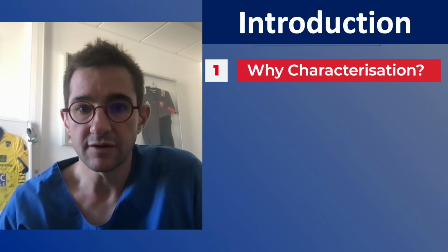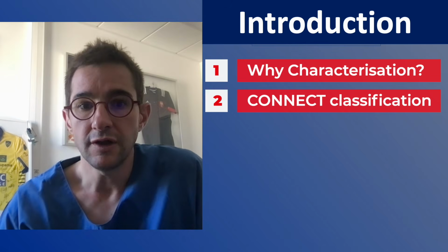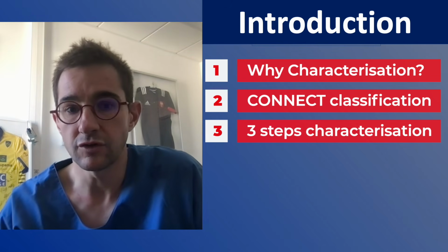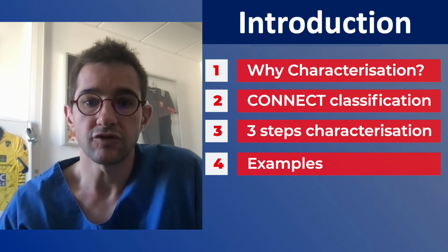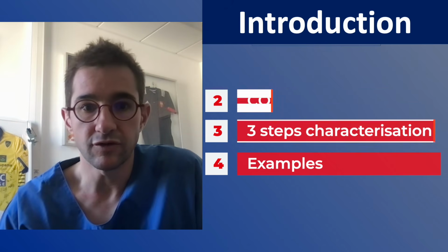So first, we will discuss why characterization is unavoidable, present you the CONNECT classification, and try to explain the 3-step characterization, which is the conventional mode of characterizing the lesions, with some examples in order to conclude the session.